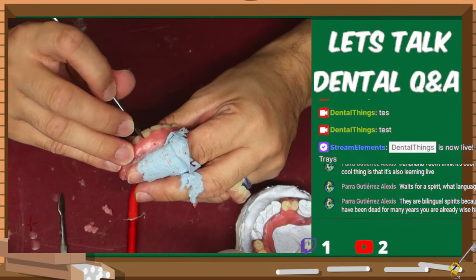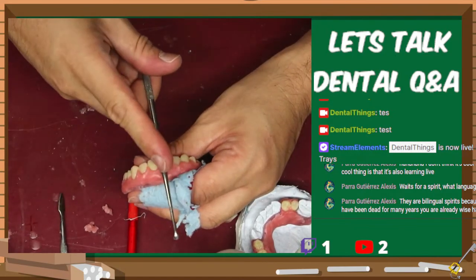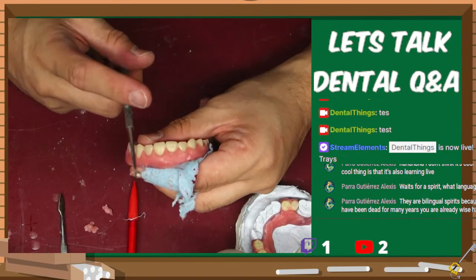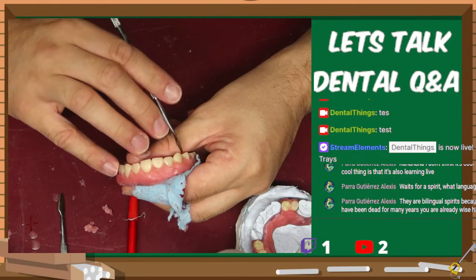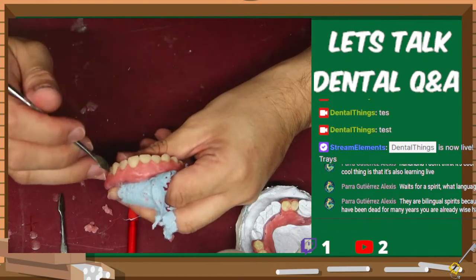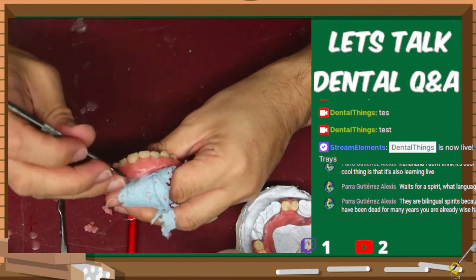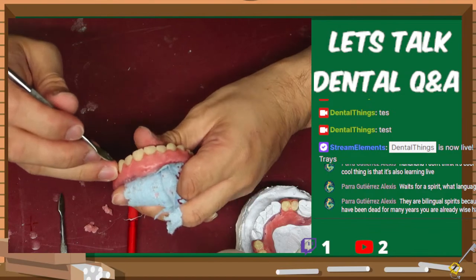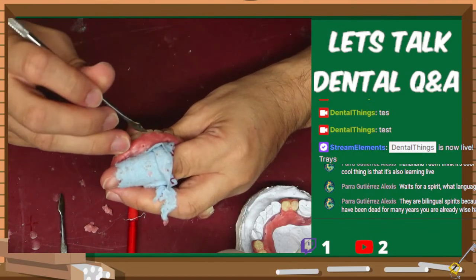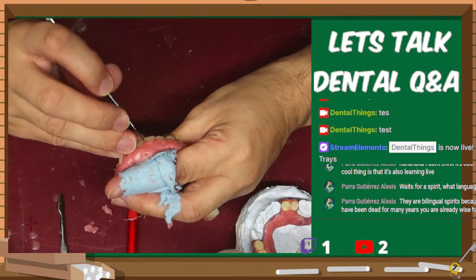And so that's good. Now we have a little bit more longer in the tooth, so this whole left side of the patient's mouth has been more altered to show more tooth rather than this side, which is a lot more gummier. So I gotta transfer a lot of what I got over here over to this side and continue on. Let's start with the central and let's match it to be right about there.